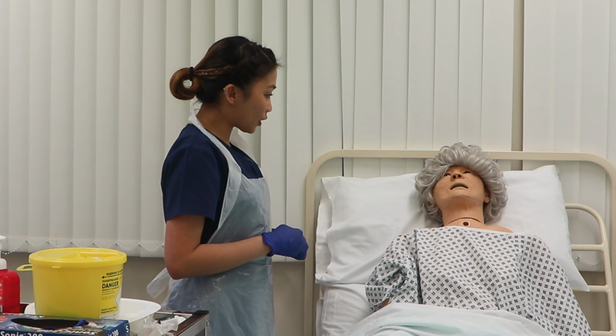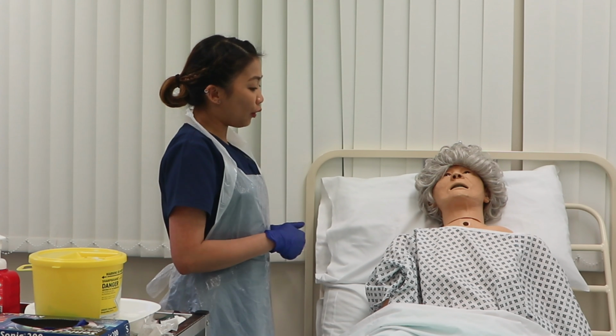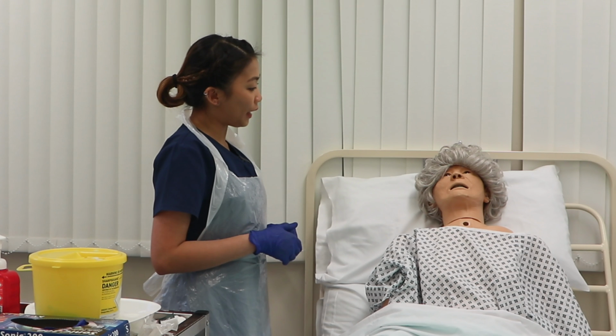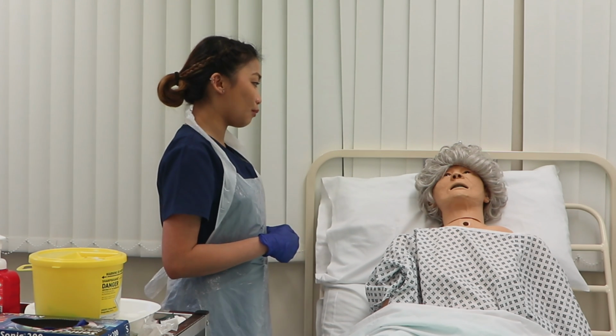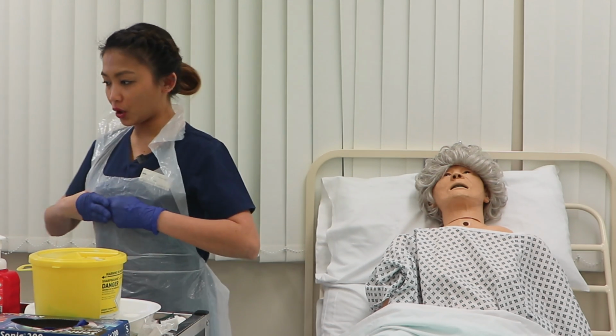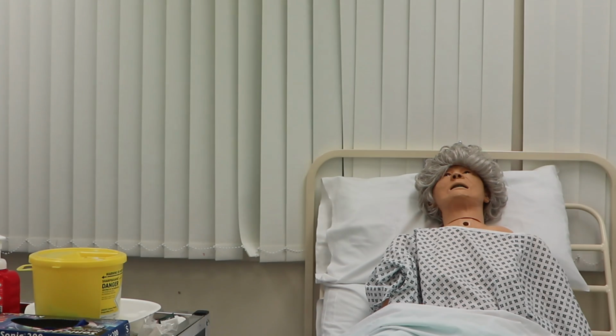Have you got any questions for me? Have you got any concerns? Alright, that's good. I will be just in the other room doing my documentation and also doing my aftercare with the equipment that I have used. If you need anything, just give me a shout and I'll be happy to assist you. Alright, thank you. Now I'll do my documentation, removing my gloves and throwing it to the clinical waste bin.